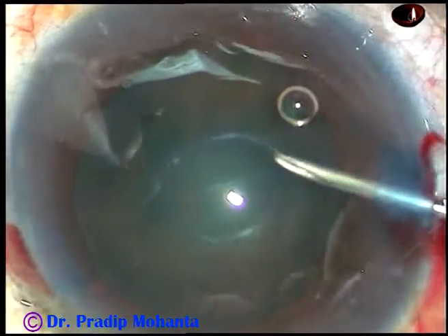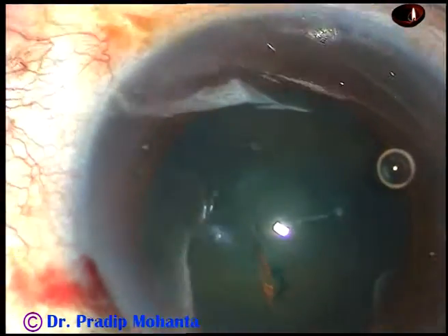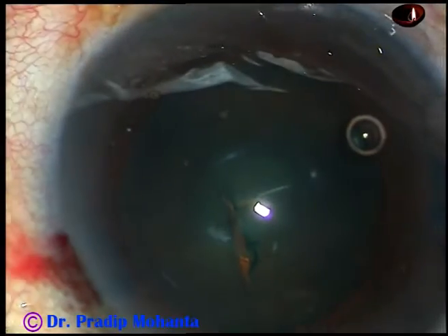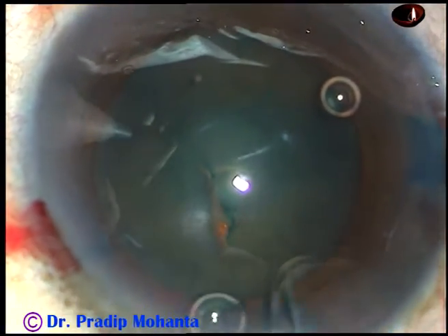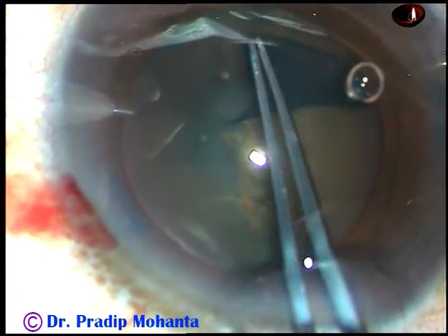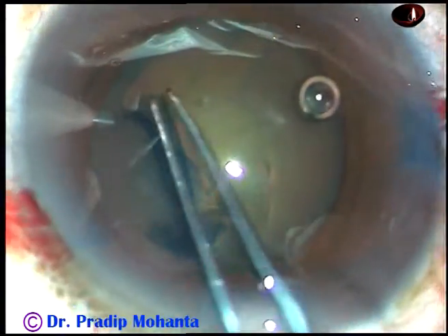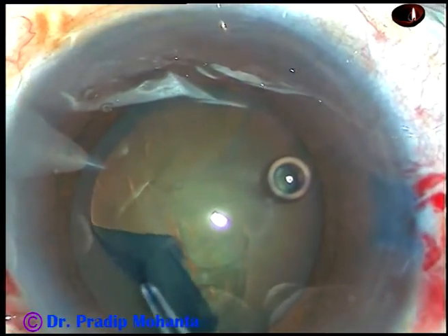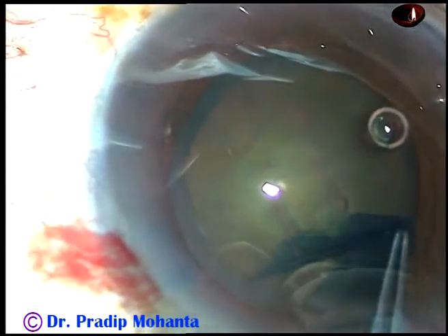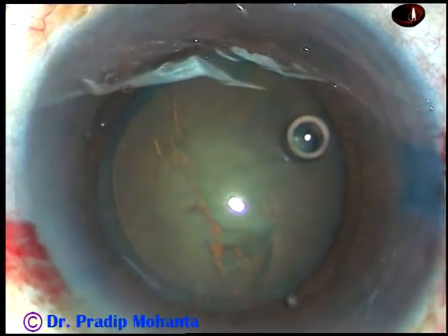I usually use a 26-gauge bent needle to incise the capsule and raise a beautiful tag which I can hold easily with Utrata forceps. Here it is. I hold this tag with Utrata forceps, go all around, remaining at a certain distance away from the margin of the pupil, and thus I complete the capsulorhexis.